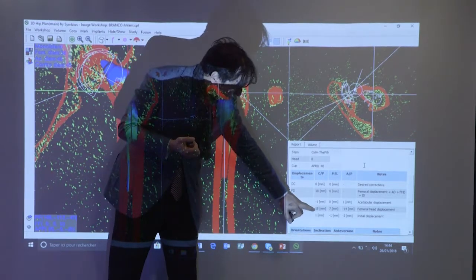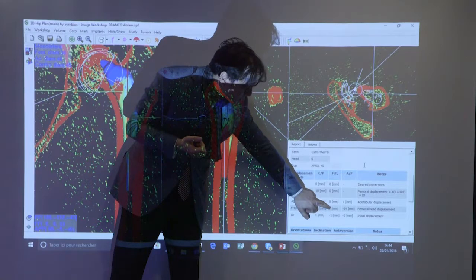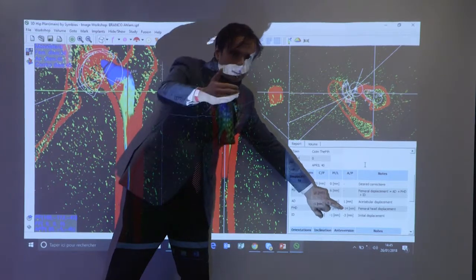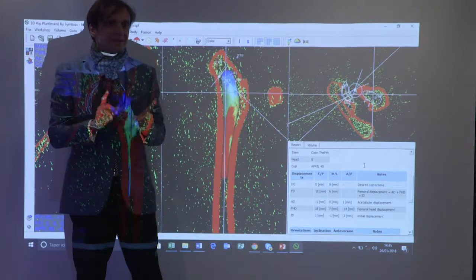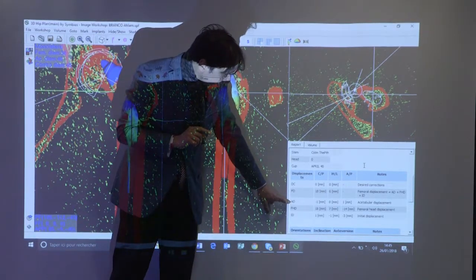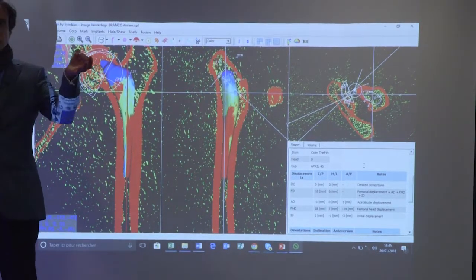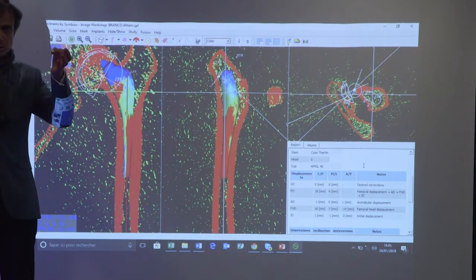For example, here, there is a lengthening, an increase in the femoral offset, and a shift posteriorly because there is this retroversion on the neck. So what we are aiming for, basically, is to get AD plus AFHD equals 0. It means the alteration of the acetabulum center of rotation is perfectly compensated by what we will do on the femoral side.